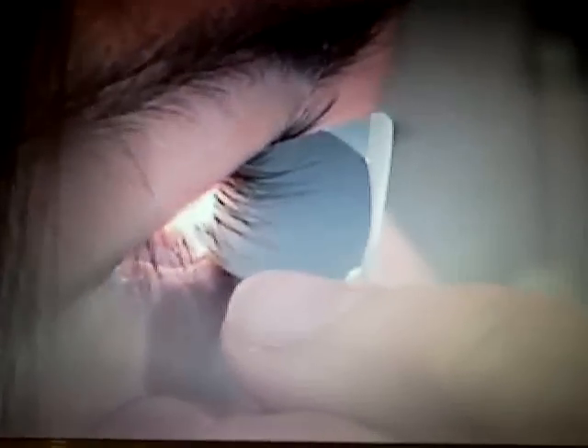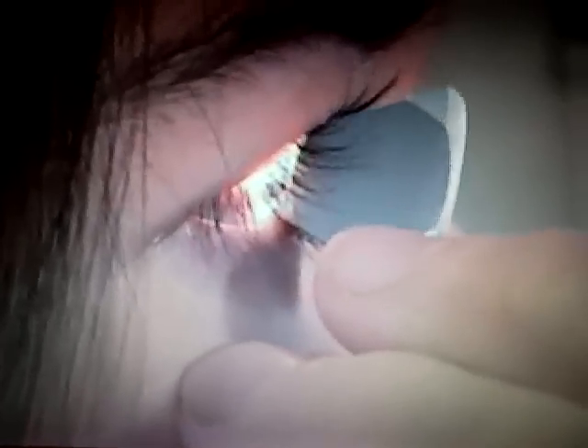I believe that this is the best lens for routine use. It is the most difficult lens to master, but it is rewarding to master. Additionally, this lens can be used for indentation gonioscopy, which is a very valuable role that is discussed in the section on techniques for difficult angles.